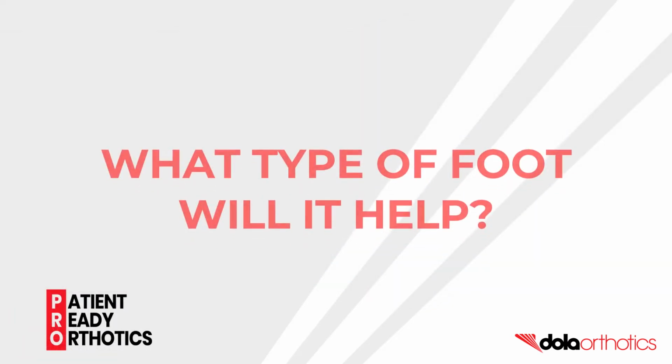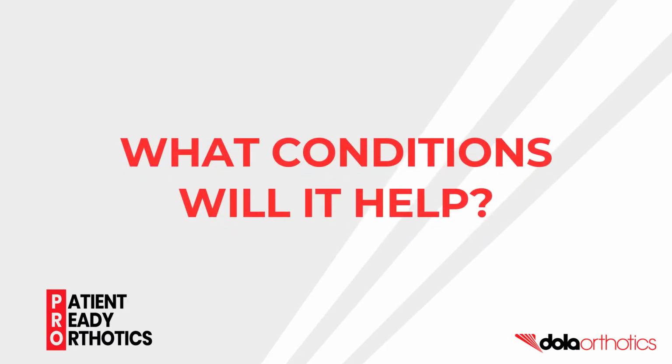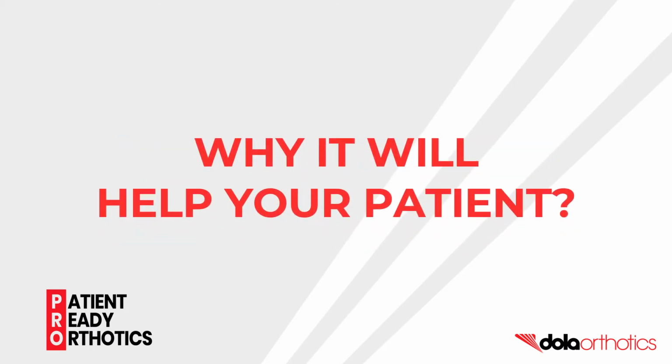What type of foot will it help? What does it look like and how does it function? What conditions will it help? And why will this patient-ready orthotic help your patients?